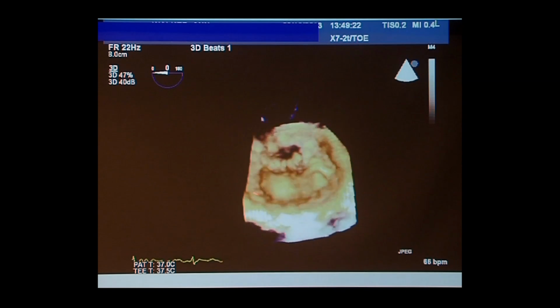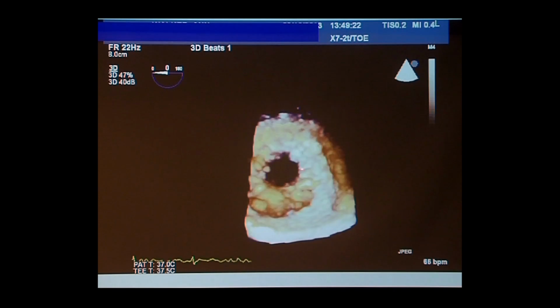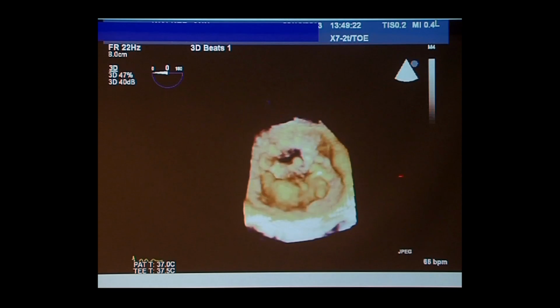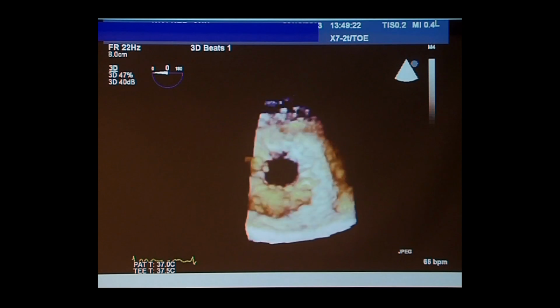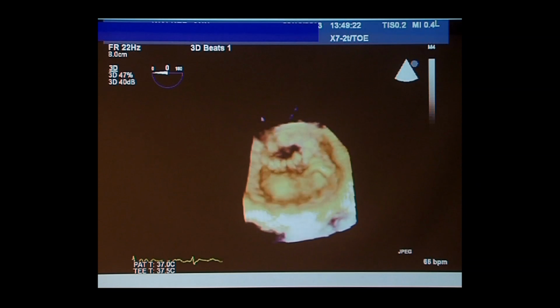So imaging has also come a great way along with this. That is a 3D reconstruction of valve function on echo, a valve which we implanted. That's a prosthetic valve. You can see the stent struts there and see how beautifully you can see the valve leaflets in 3D, opening and closing. So essentially, the amount of imaging data we get now is phenomenally good. And this has completely transformed the way we do procedures because the amount of guidance you can get with these things is very, very good.